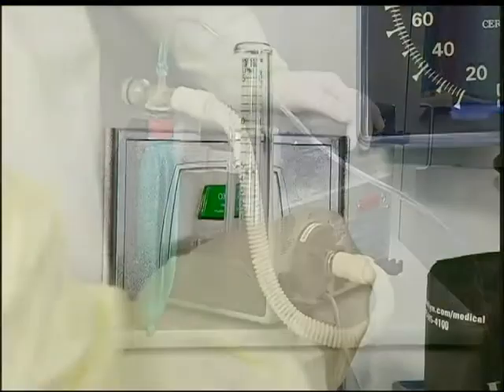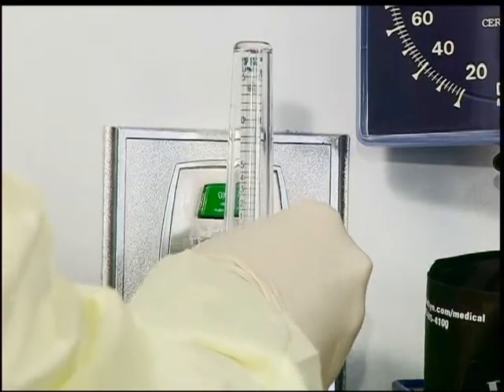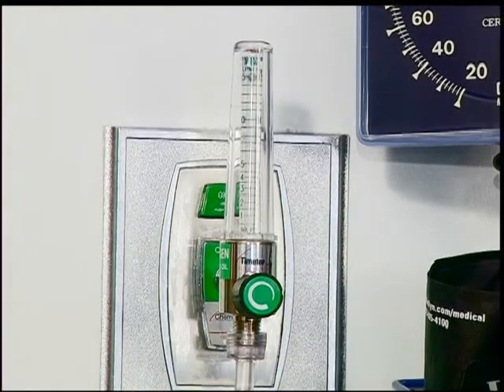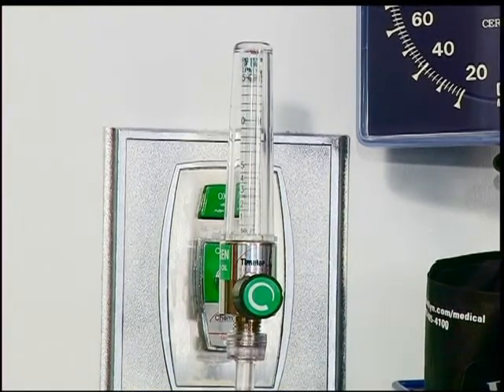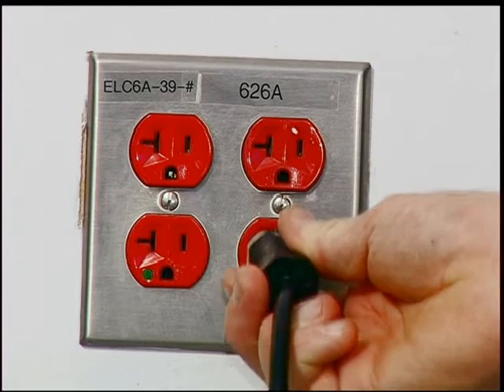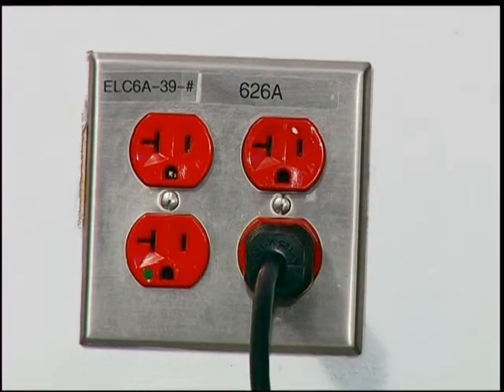Supplemental oxygen can be adjusted by increasing or decreasing the flow on the flow metering device. The precise oxygen concentration may not be known. The external power supply is simply a standard AC 110-volt plug adapter that plugs into a wall outlet in order to use external power and not the unit's internal battery.